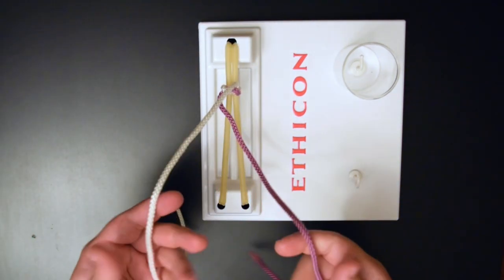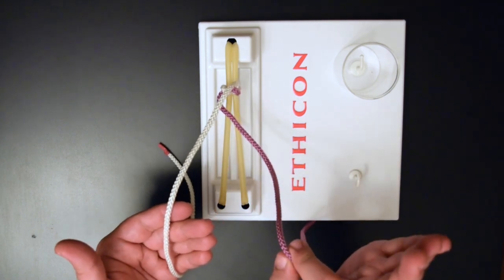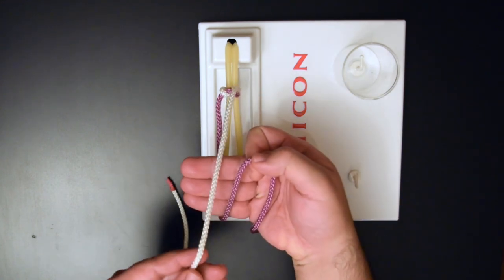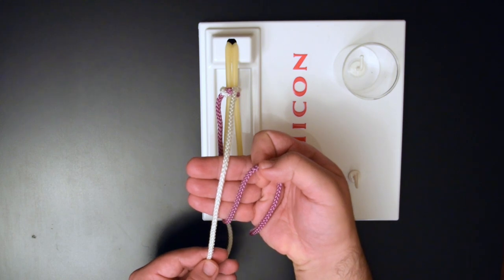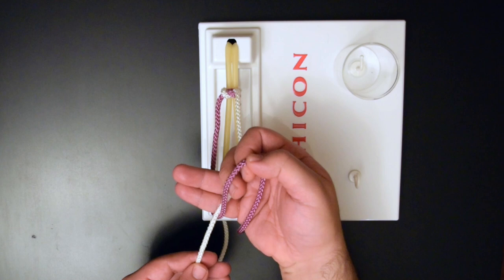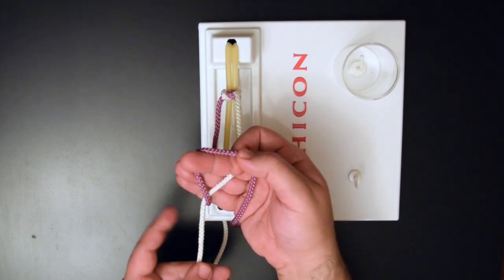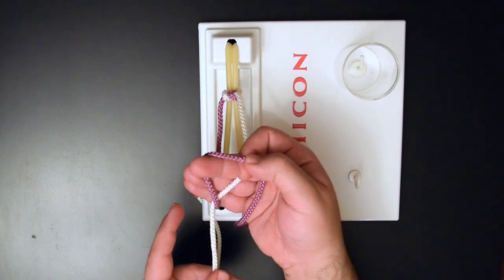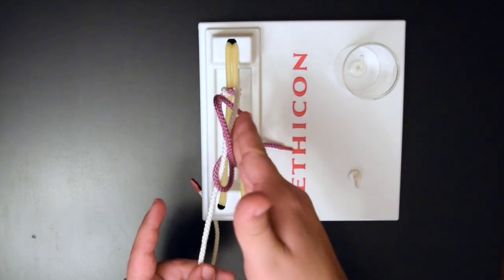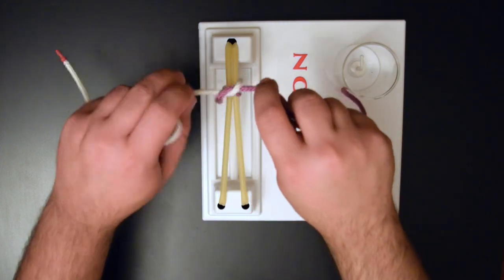Come back to your neutral position. Give the OK sign — you're ready to go again. Cut your suture, cross the strands over your three fingers, flex your middle finger, and catch the purple strand on the back side of your middle finger. Pinch it between your middle finger and ring finger, let go with your index finger and thumb, bring your hand across the bridge, pull the suture through, and throw it down.